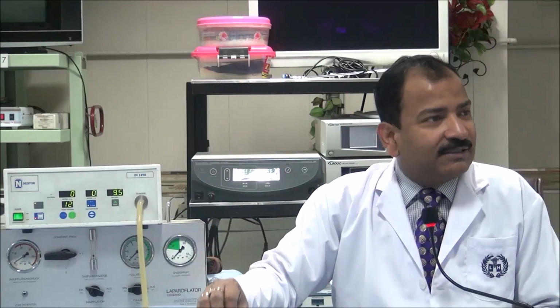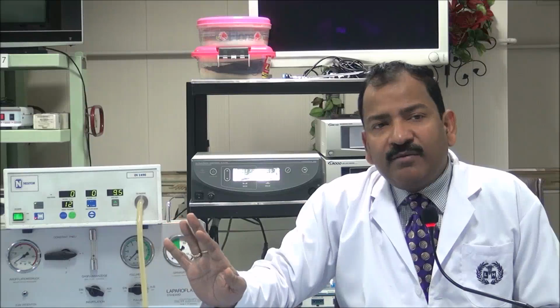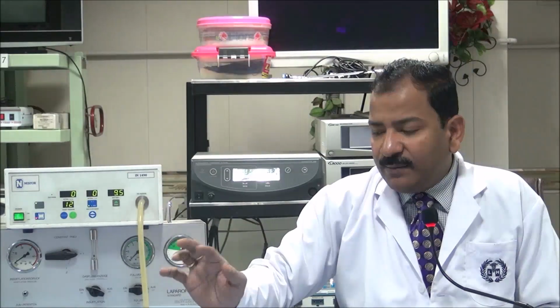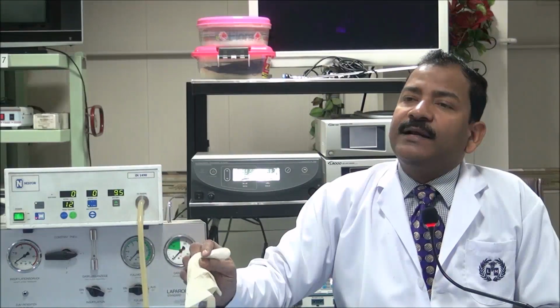So we are setting 1 here, but actually if you see, the effective flow is only 500 ml per minute. So it is not a problem of air embolism. Now next question. Preset pressure is 12. Actual pressure is 12. Flow rate is 0.5 liter per minute, half liter per minute. And the total amount of gas used is only 500 ml.